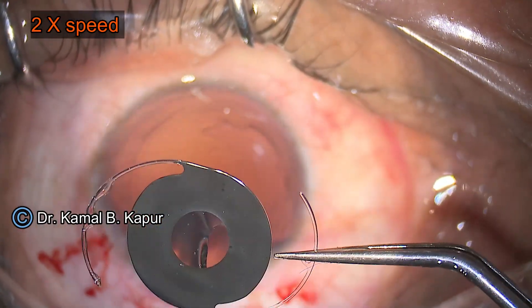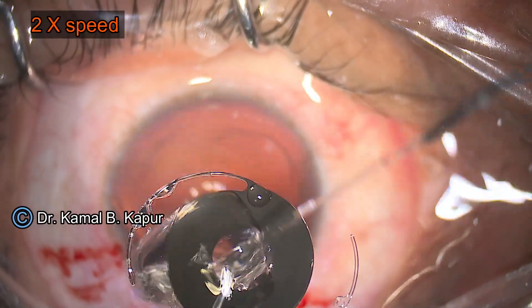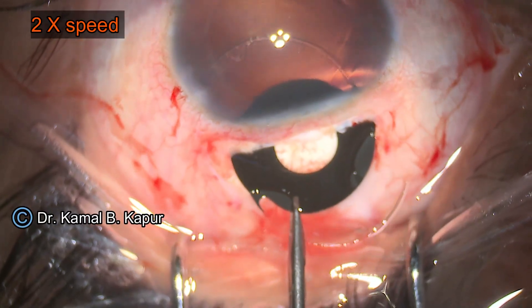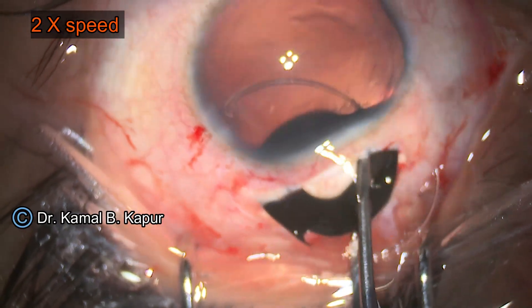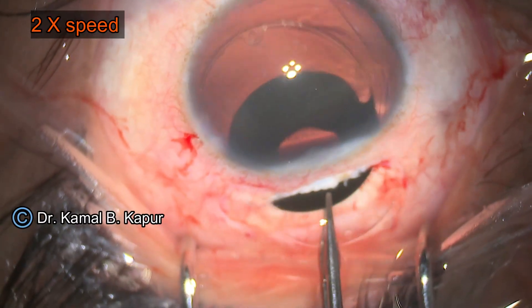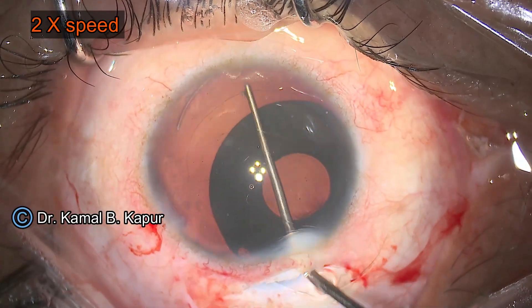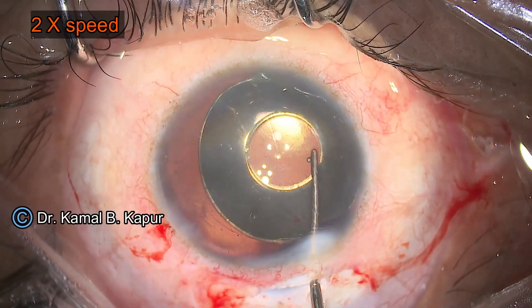Here you will see me showing the lens now. The trick of implanting this lens is to make sure that the leading haptic is totally inside the wound before you start pushing in the optic. There is a slight tightness of the wound — approximately 0.25 millimeters smaller than the total diameter of the lens. Without putting much pressure, we engage the eyelet of the PMMA haptic into the bag.